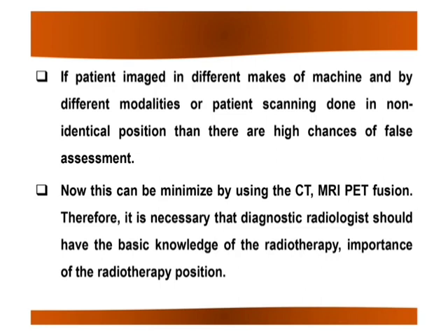Let me tell you about the CT MRI fusion, how we do it. For the CT MRI fusion technique, you first put the CT scan along with the marker, and the CT simulation is done, and then you acquire the images of CT.